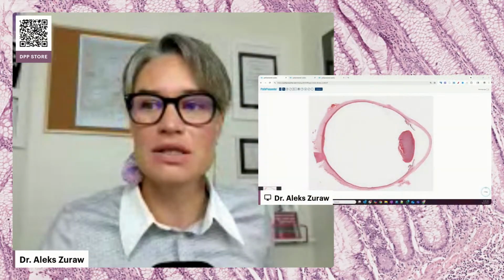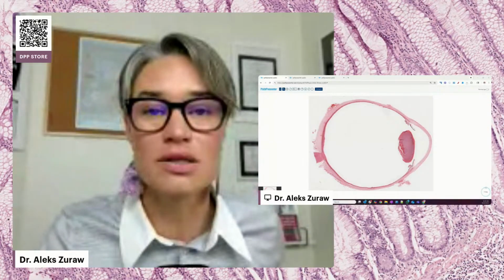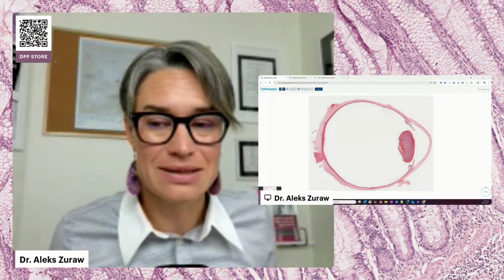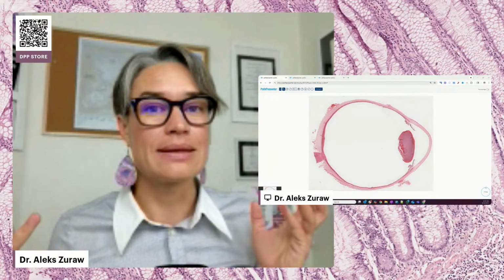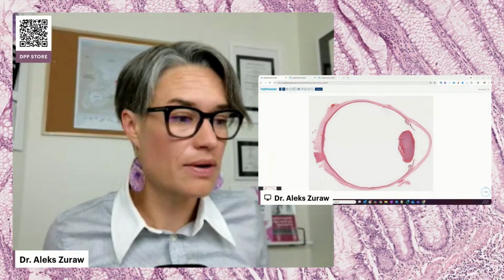And also, those slides that we were viewing now were possible. I was able to show them to you because of a technology called digital pathology. This is something I have been promoting for the last 10 years. Digital pathology makes us able to view glass slides, to view tissue digitally.